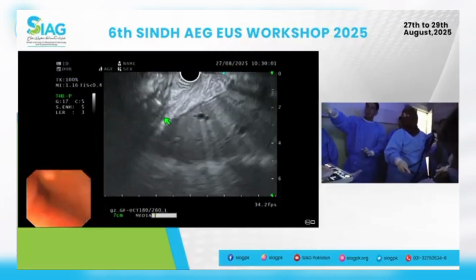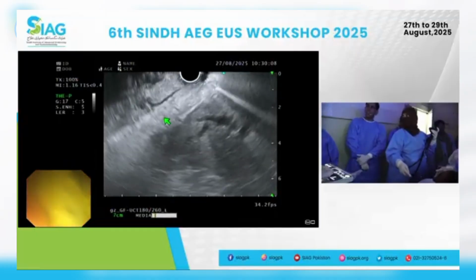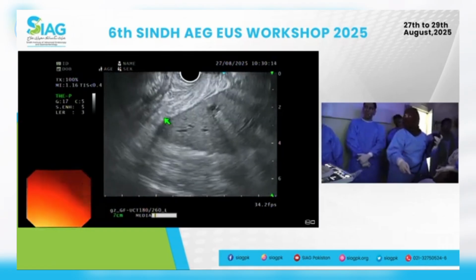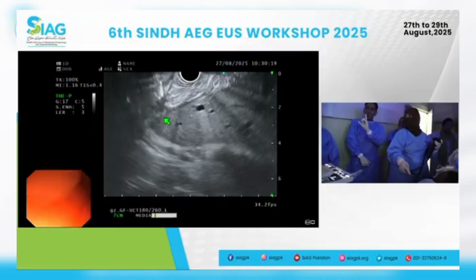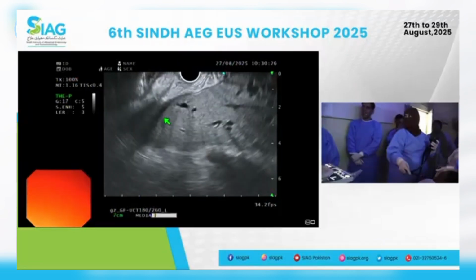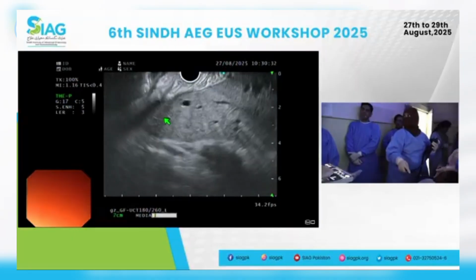Good. Okay. Now the second thing is, can you see any focal lesion in the liver? Good. So what you want to do is keep scanning the liver and see what else you see. Dilated ducts. Fantastic. Excellent. So the intrahepatic ducts remain dilated, no perihepatic ascites, no focal lesions so far. Yeah, good. Excellent. So you're improving your coupling, you're ensuring there's no air. Good. Excellent. Can you appreciate any pneumobilia? Would you use your Doppler at all?